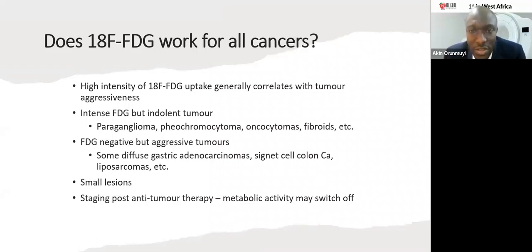Sometimes some physicians just overlook them, but you might be looking at something and say, oh, the doctor missed this, or why is he calling this benign? But there are tumors that have intense FDG uptake and are not malignant. There are also aggressive tumors that would not take up FDG, either because the tumor does not depend on aerobic glycolysis, or some tumors are so aggressive they have alternative metabolic pathways that do not rely on FDG.